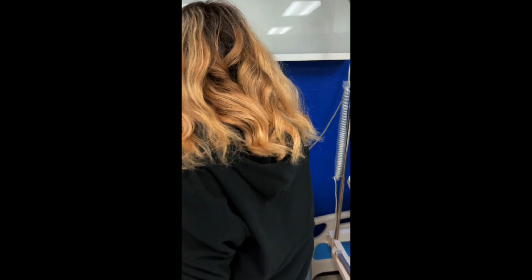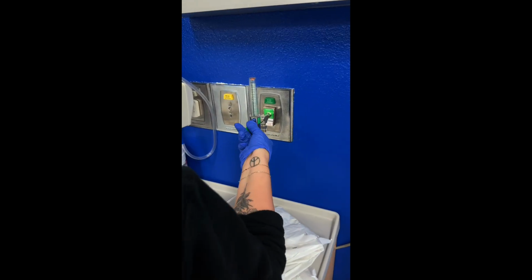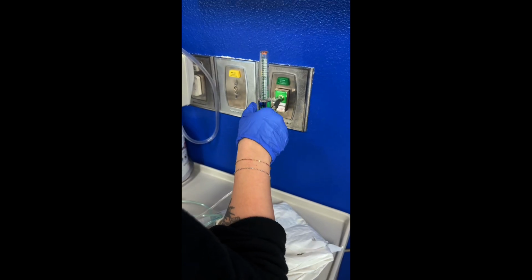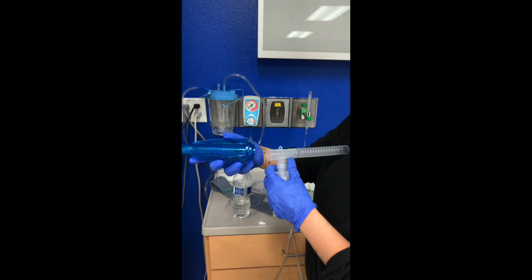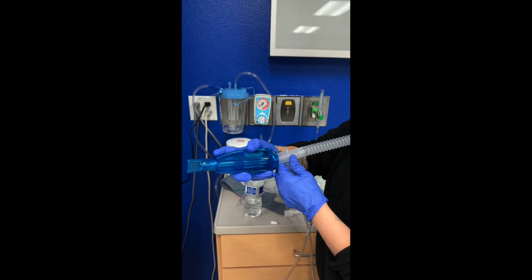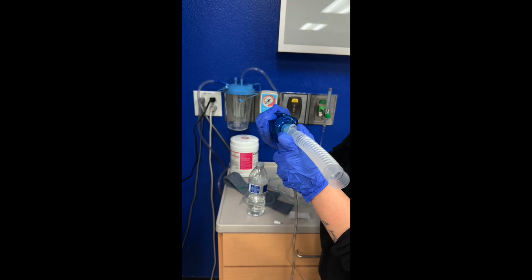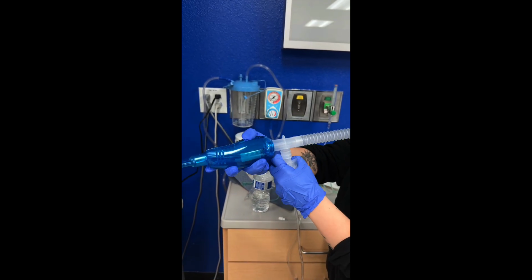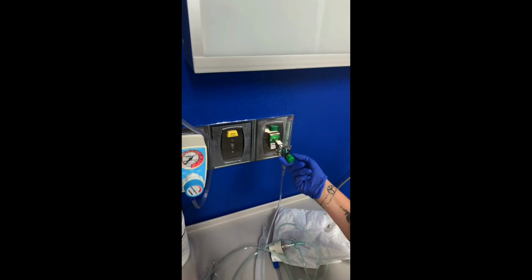Next, I connect the nebulizer to the inlet of the Acapella device, making sure the connection is tight and secure. I attach the mouthpiece to the Acapella device. After that, I connect the oxygen or air tubing to the bottom of the nebulizer and attach it to the flow meter. The flow meter is set to 6 to 8 liters per minute, and I confirm that a visible aerosol mist is being produced.